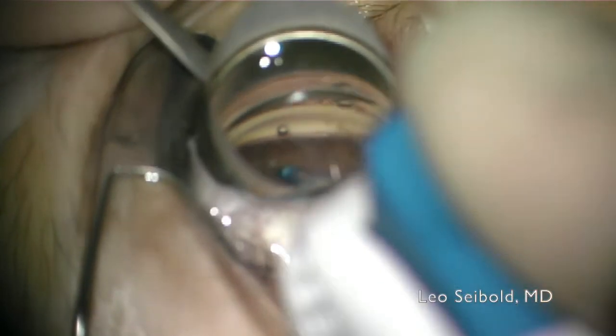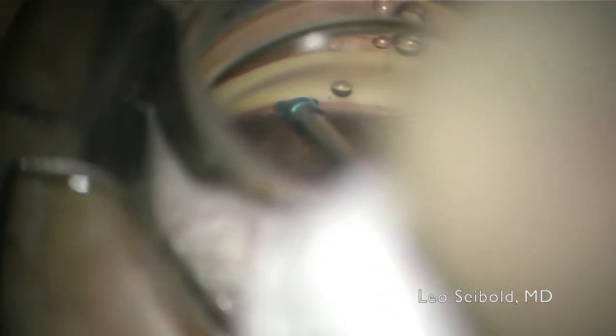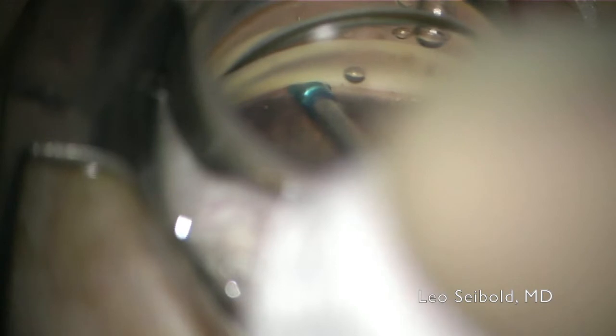After a first priming injection on the surface of the eye — this just helps to clear any bubbles from the cannula — the device is inserted into the eye and the blue sleeve is applanated against the trabecular meshwork. As the button is pushed, you can see a nice blanching of Schlem's canal, and the blood that was there is now displaced, indicating the OVD has been injected into the canal and a precision goniotomy has been performed.